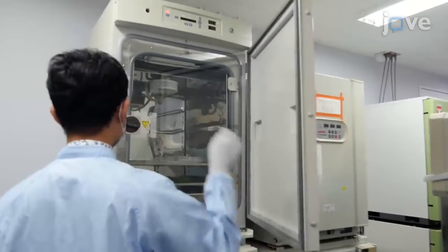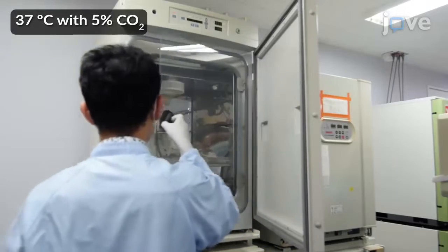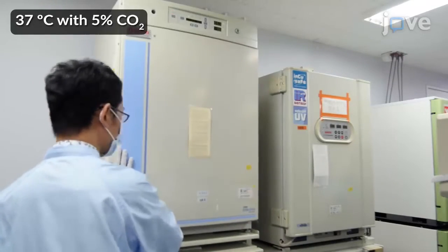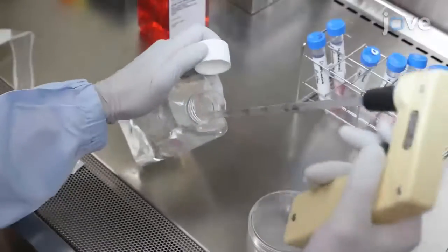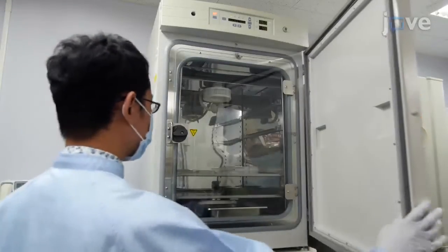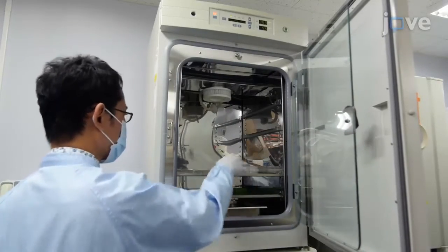Grow human pluripotent stem cells, or HPSCs, to between 70 and 80% confluency on an LM511E8-coated 6-well plate in mTeSR1 medium. 4 days prior to hemogenic induction, aspirate the medium and wash twice with PBS. Rinse the cells with dissociation solution and incubate at 37 degrees Celsius for 15 minutes.